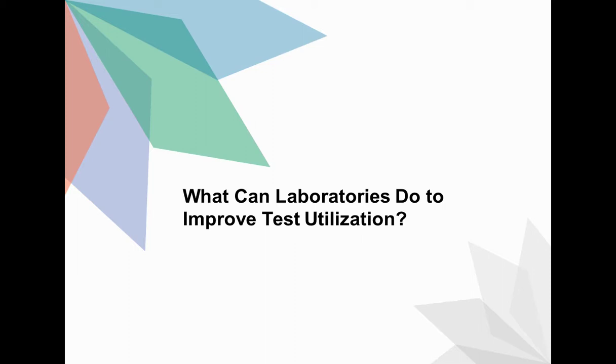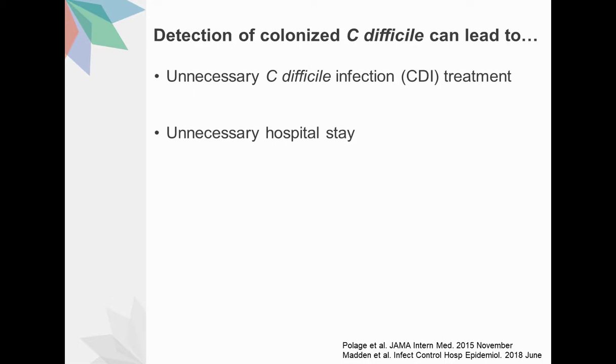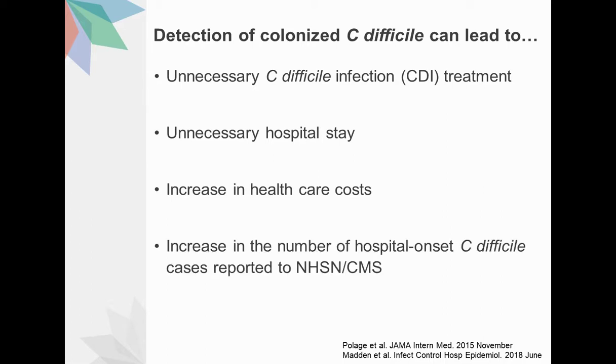Thank you, Dr. Carroll. Hello, everyone. From here, I would like to discuss what laboratories can do to improve C. difficile test utilization. Unfortunately, we currently do not have a diagnostic test that can reliably differentiate C. difficile infection from colonization. If the tests are not ordered appropriately, we may detect colonized C. diff, which can lead to unnecessary CDI treatment, unnecessary hospital stay, and associated healthcare costs. It can also lead to an increase in the number of hospital-onset C. diff cases reported to CMS through the National Healthcare Safety Network.